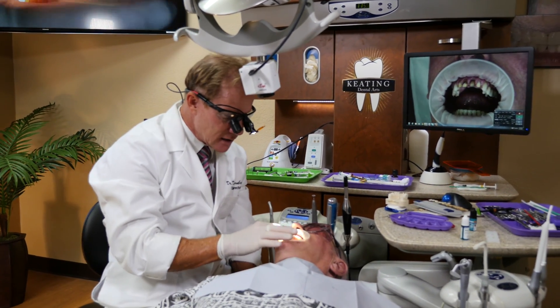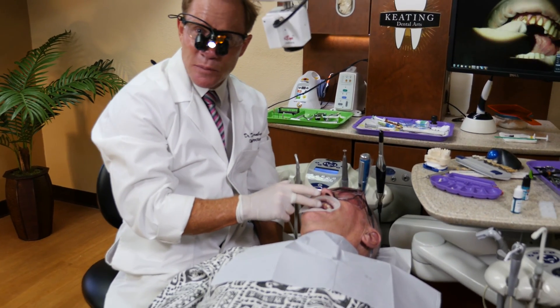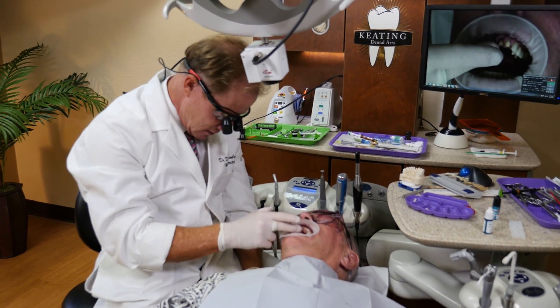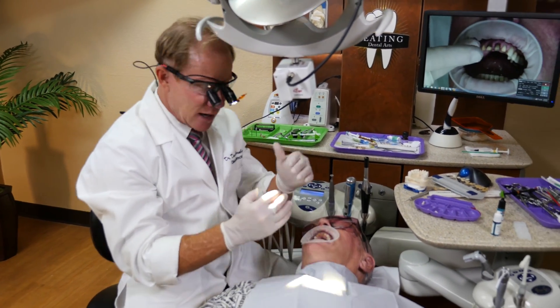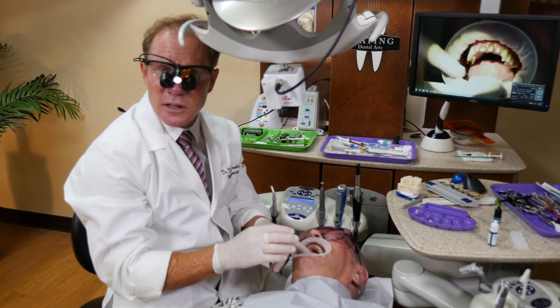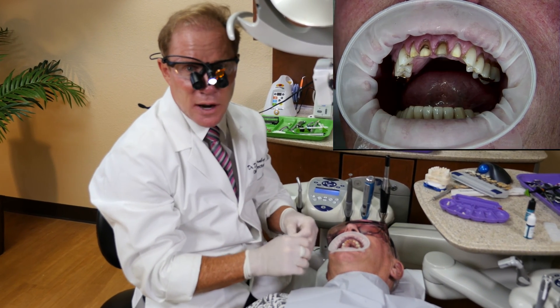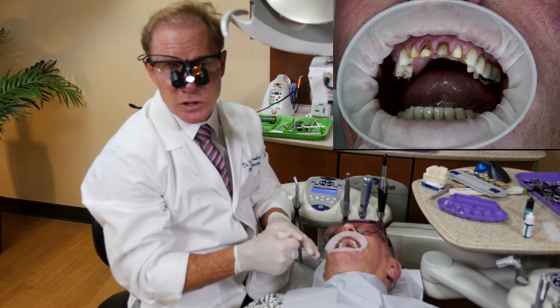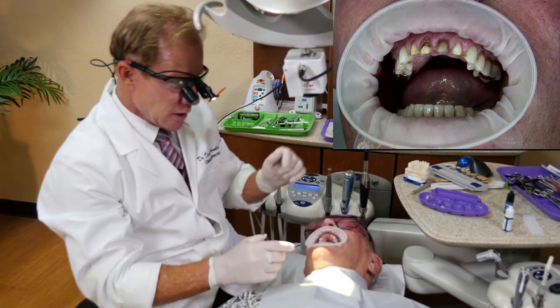Dale here has a lot of stuff going on — dark preps due to endodontic treatment and PFMs that have been on there for 57 years. We chose monolithic zirconia for a number of reasons: he's got an end-to-end bite, he's broken teeth in the past. The new aesthetic material is very, very translucent — it rivals most of the all-ceramic materials such as the lithium disilicates and the leucite reinforced ceramic.